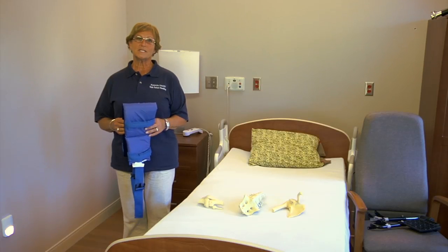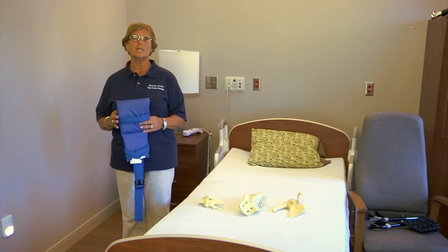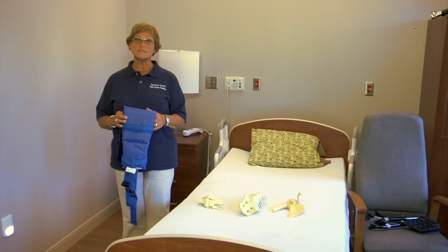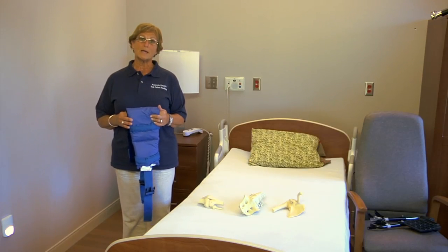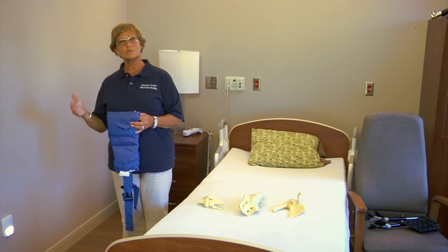Okay, in summary, as you can see, that pivot transfer that you witnessed is a perfect example of the type of transfer that's getting us injured. It's loaded with risk, and it's loaded with risk to all three of the joints that Bob was talking about: the shoulder and neck, the low back, and the knee. The same injury that occurs to the patient occurs for the healthcare worker.